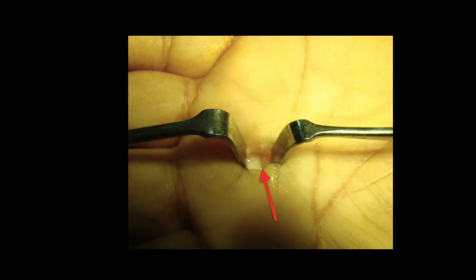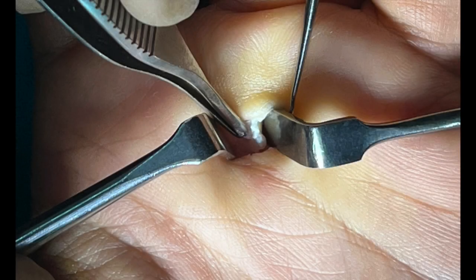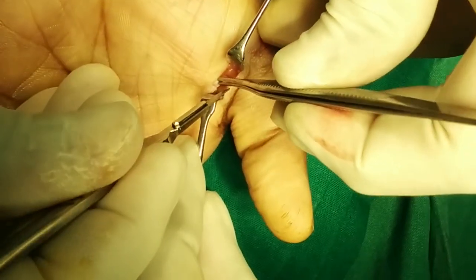Once the A1 pulley is identified, we then look for the junction between the A1 pulley and the flexor tendon and start incising the A1 vertically along the center in line with the flexors. Excising a part of the A1 pulley has shown to have reduced risks of scarring, flexor tendon adhesions, and recurrence of trigger, and therefore avoiding post-operative complications.